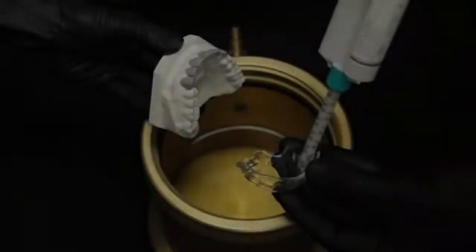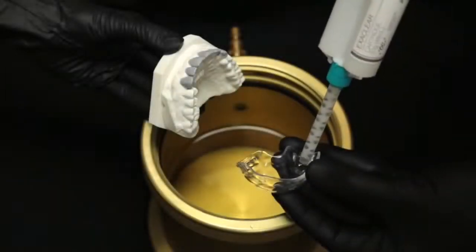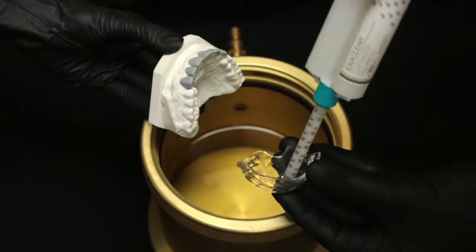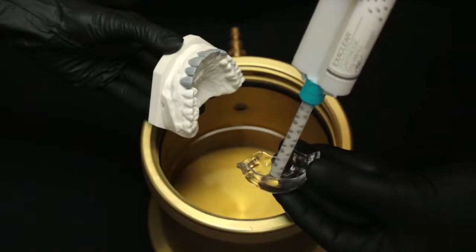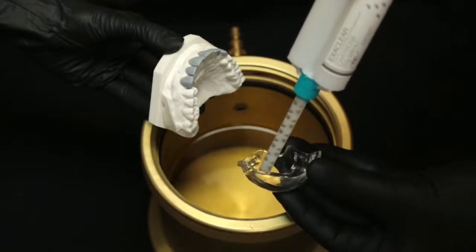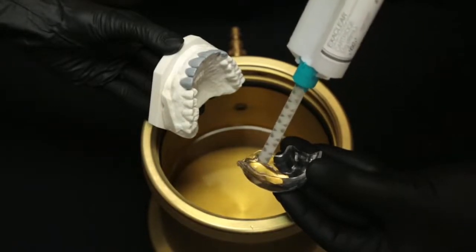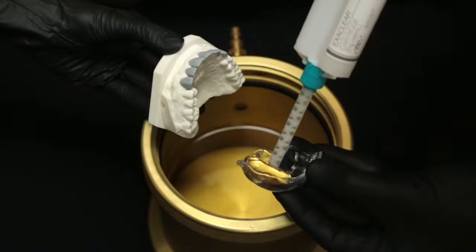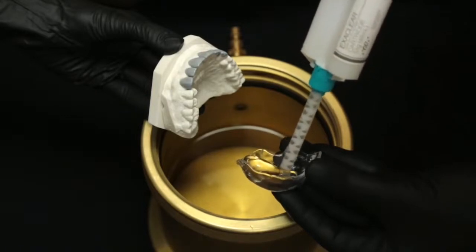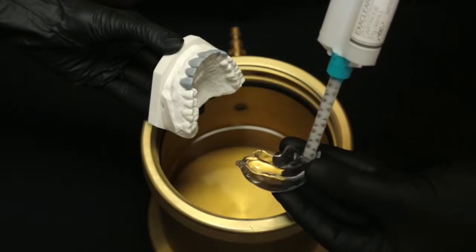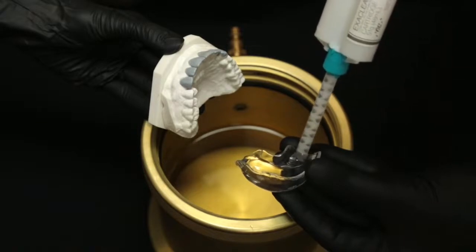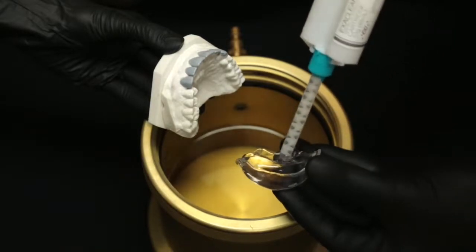A clear polyvinyl siloxane material, Exaclear by GC, was injected into a non-perforated tray. This can also be performed on a stone model that is a duplicate of the wax-up, or in some cases from a pre-existing diagnostic model where there is no requirement for change in the anatomical form of the natural dentition.